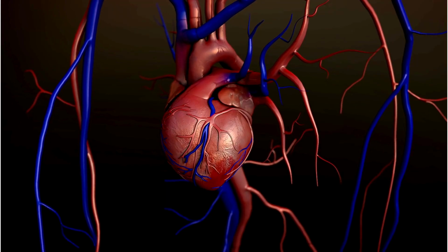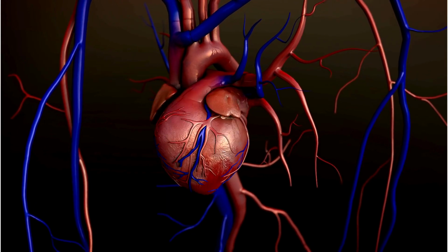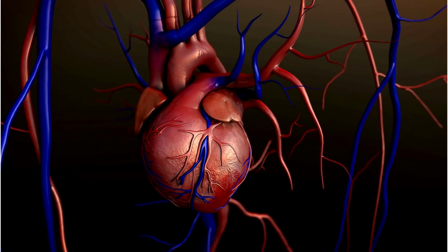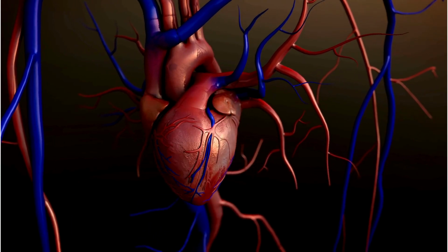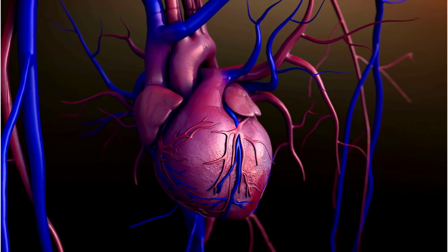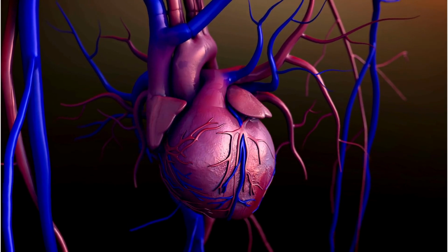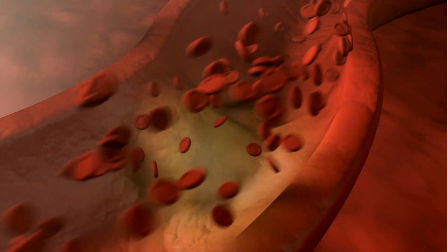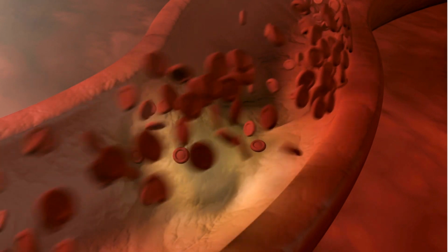After the procedure, patients are observed for a period, and they may need to lie flat for a few hours to prevent bleeding at the catheter insertion site. Recovery times vary depending on the procedure and individual patient factors. Cath lab procedures are performed by a specialized team, including interventional cardiologists, nurses, and technologists, in a controlled environment with advanced imaging equipment. The choice of procedure.